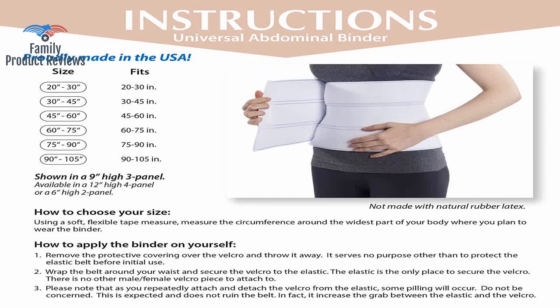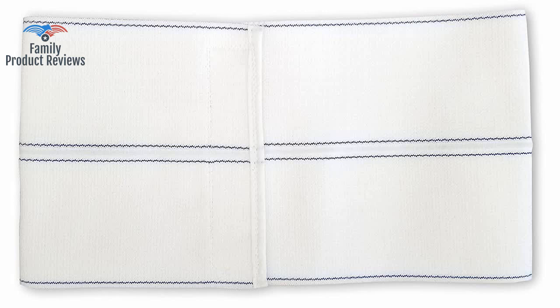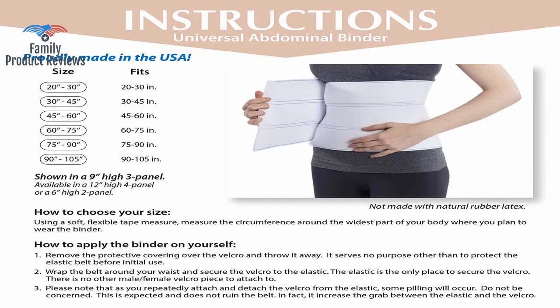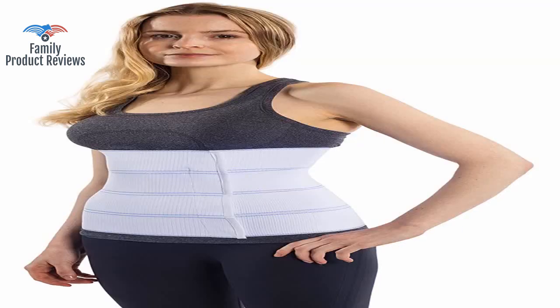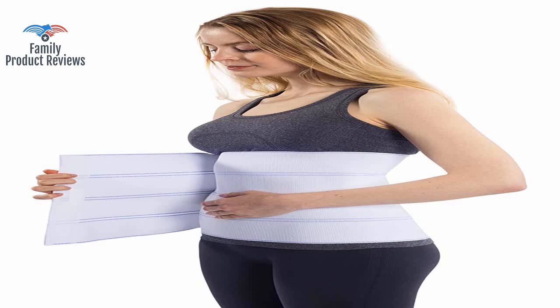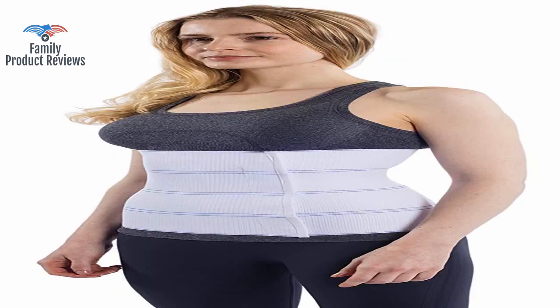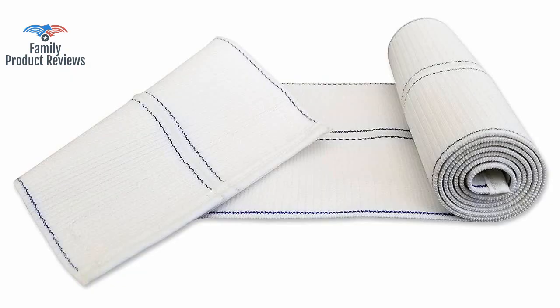Also, if you're not sure how many bands you want, order one up, and you can cut it off if you don't end up liking it that tall. The solution is to hold the belt like a bath towel behind you, and bring the ends together in front, or on the side. Then fasten it in place. This method is much easier than trying to hold one end in place while grabbing the other side and maneuvering it around your body, at least for me.